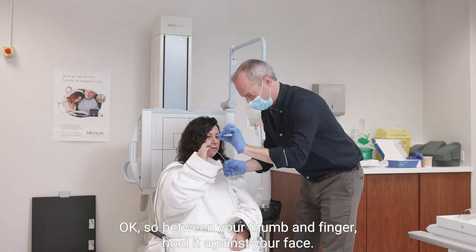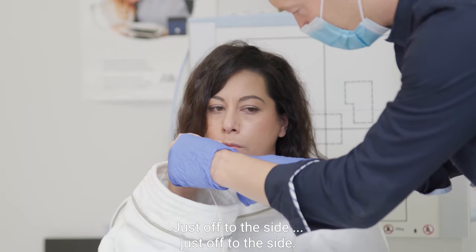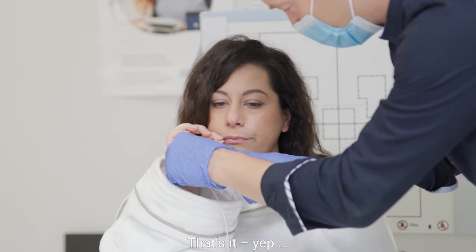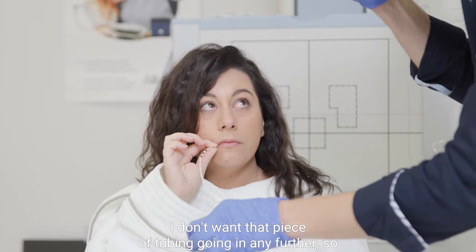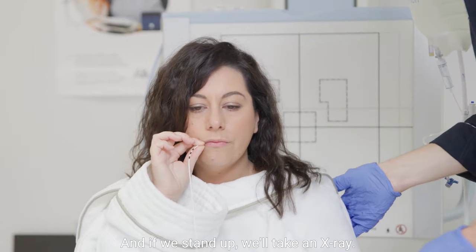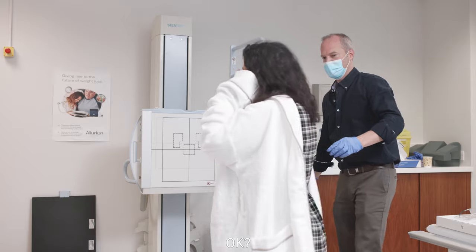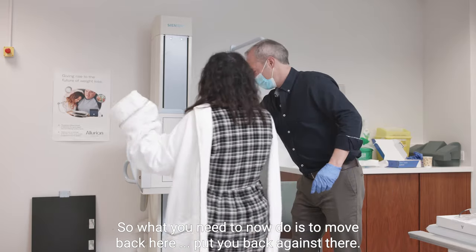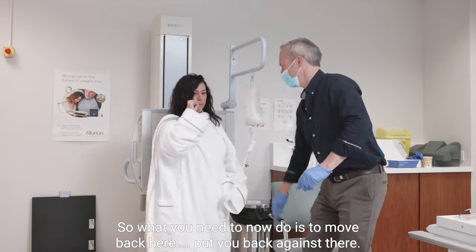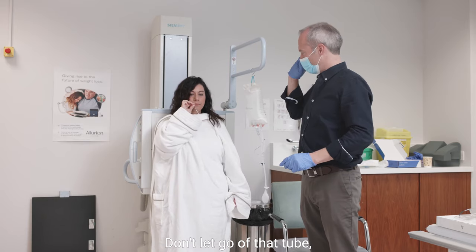So between your thumb and finger, hold it against your face, just off to the side. I don't want that piece of tubing going in any further, so hold that tubing quite tightly. Well done. And if we stand up, we'll take an x-ray. So what you need to do is move back here, put your back against there, and we'll get the x-ray technician to take the x-ray. Don't let go of that tube.